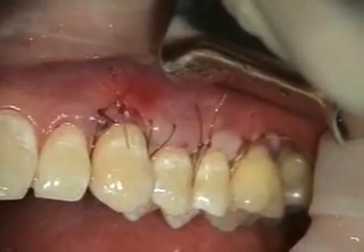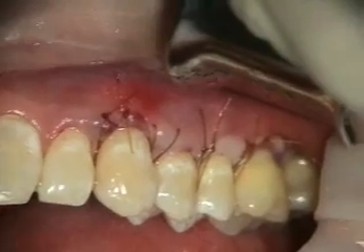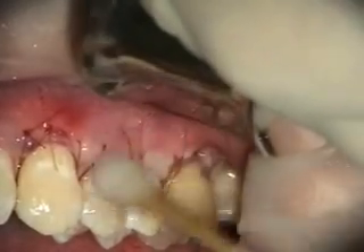We're done with the coronal positioning on 12-13, alloderm grafting, root coverage on 11, and also on number 14. We're going to put periopaca on and take a look at it in a couple weeks.